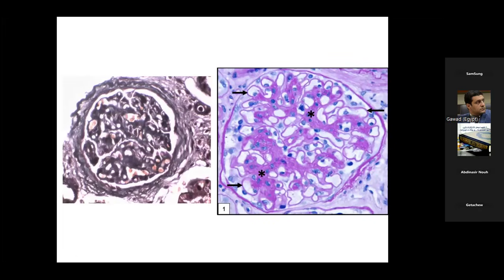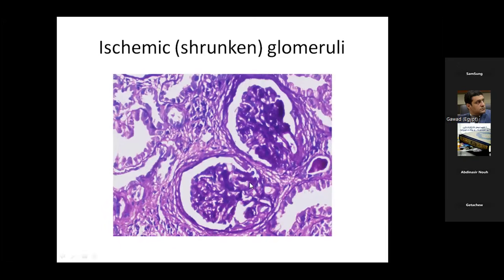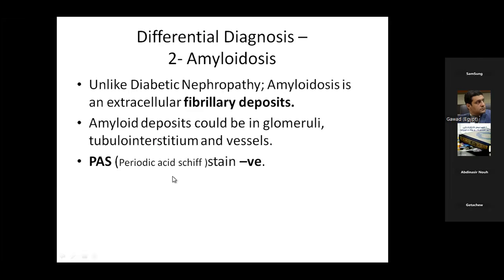we have seen for diabetic changes. And you can compare, this is a smaller shrunken glomerulus. The glomerular basement membrane is more or less thick and is more shrunken, with periglomerular fibrosis rather than a thickened Bowman capsule. So this is a shrunken and ischemic tuft. Another two shrunken tufts with more expansion in the Bowman space, secondary to these ischemic tufts with periglomerular fibrosis.